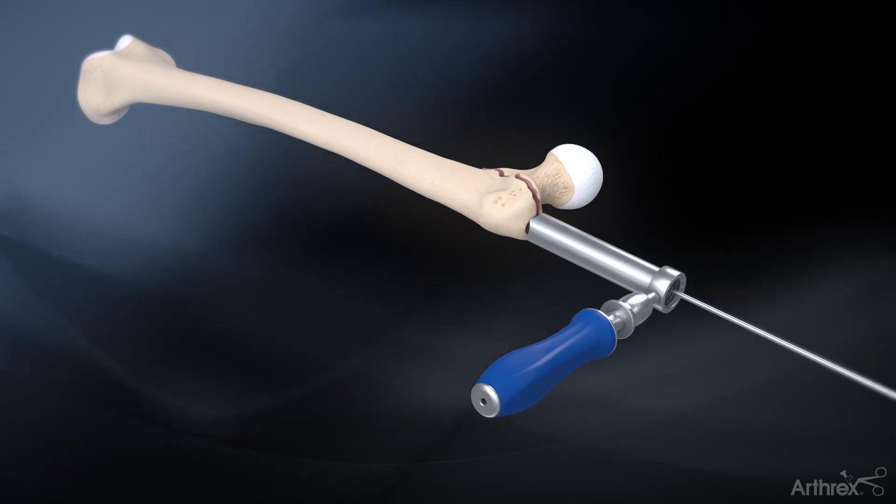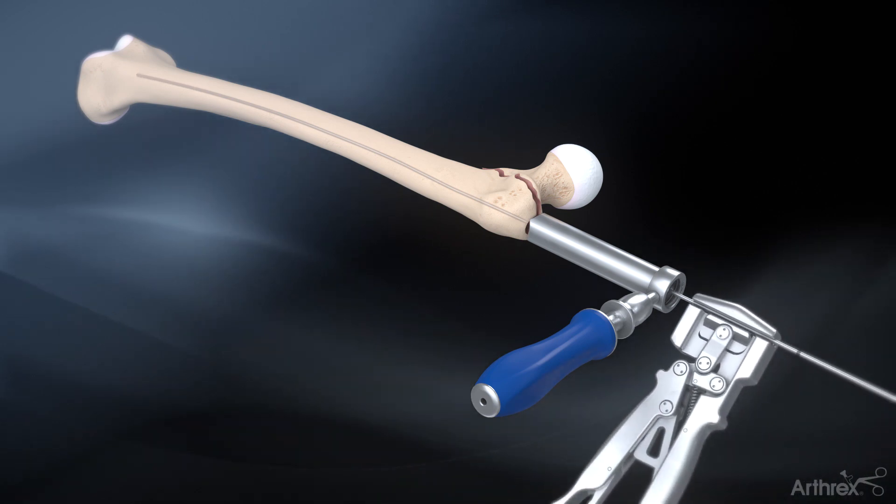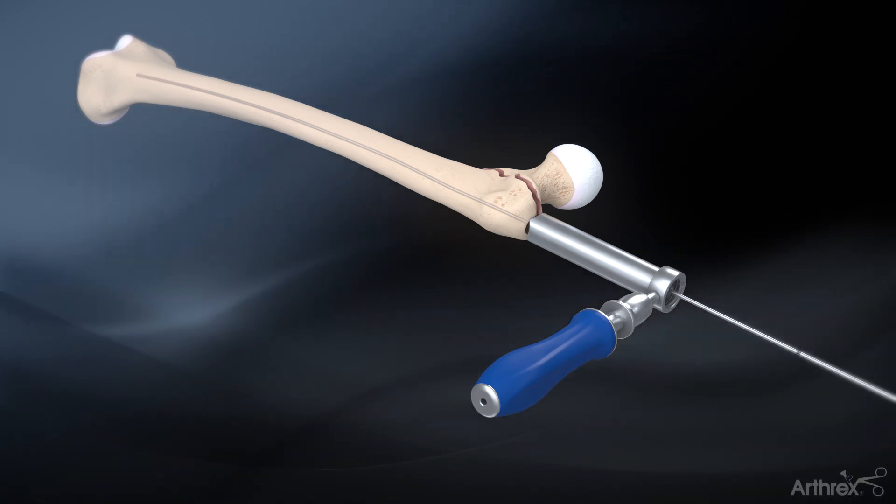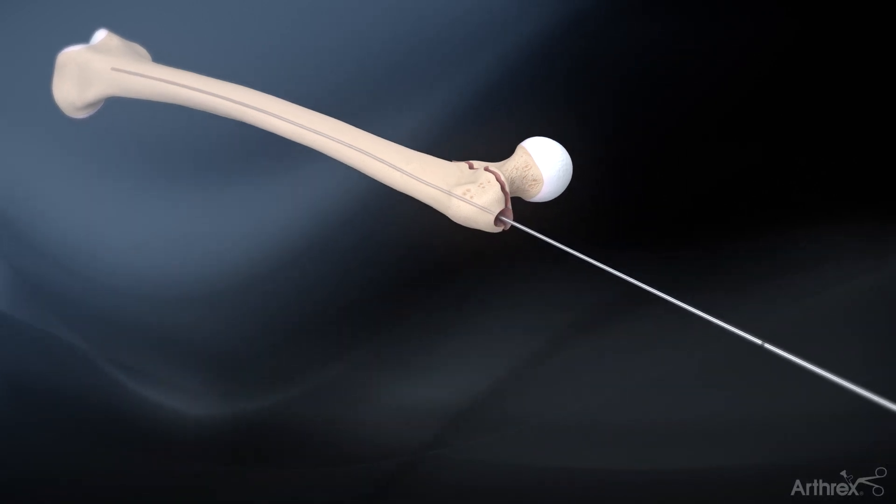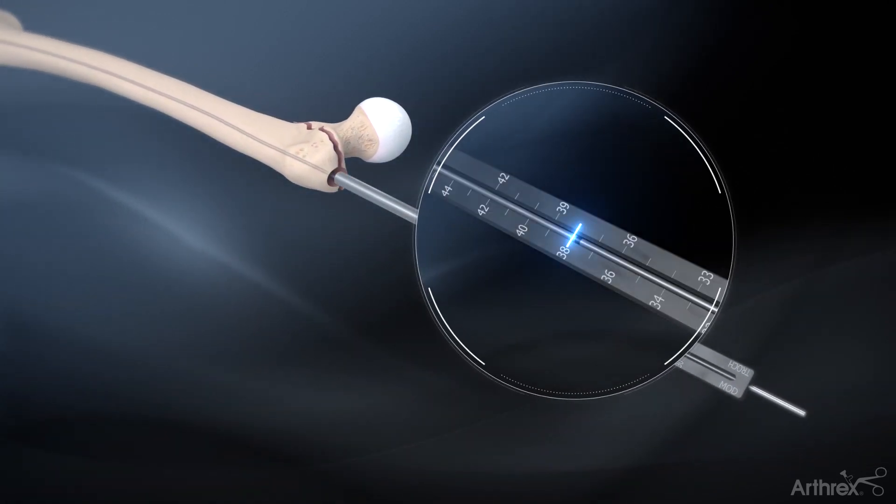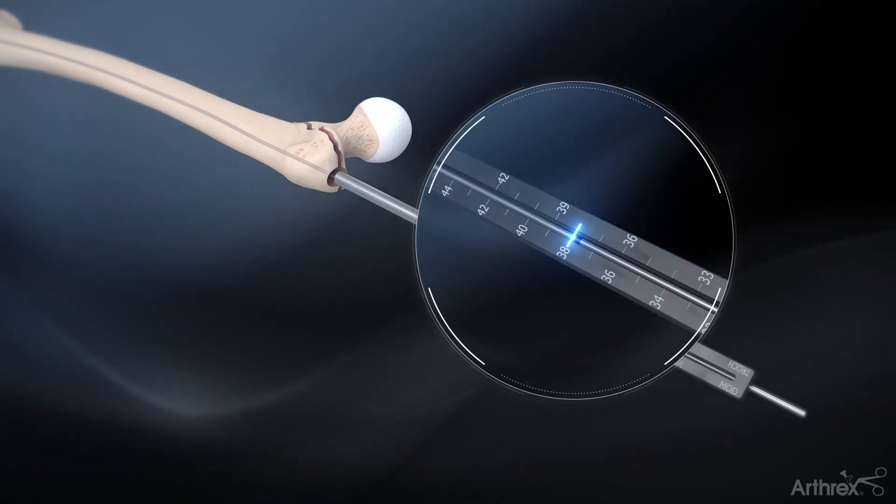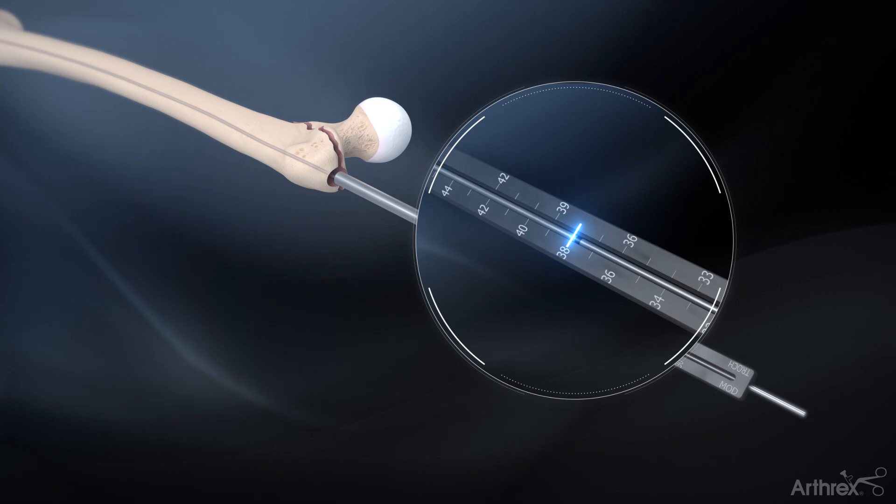The 3.2 mm guide pin is removed and the 3.0 mm ball nose guide wire is introduced down the shaft of the femur using the guide wire gripper. The length for the ES trochanteric nail and long trochanteric nail is determined by sliding the guide wire depth gauge over the guide wire to the greater trochanter and reading the measurement from the laser mark on the guide wire.